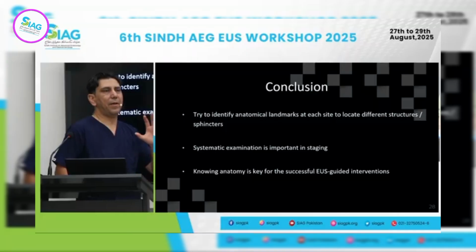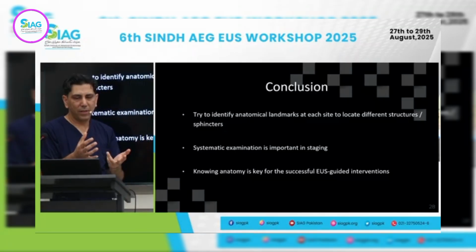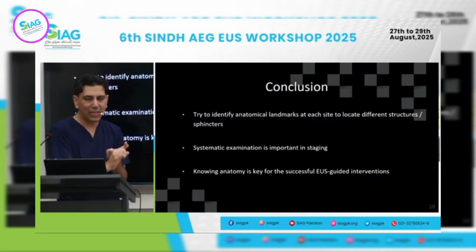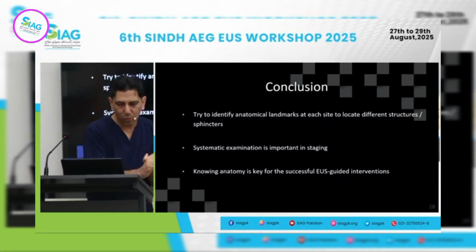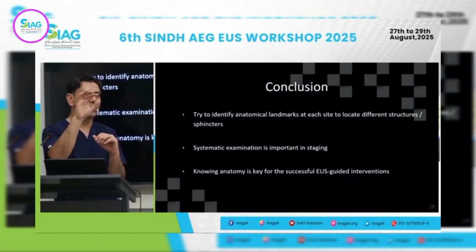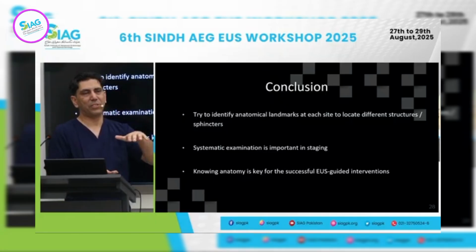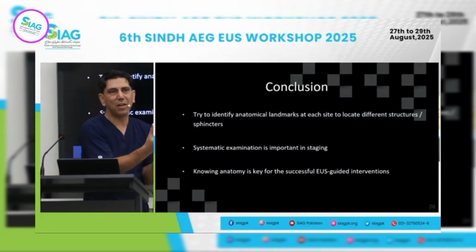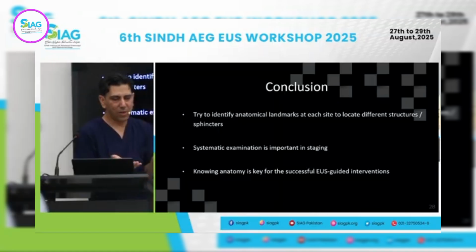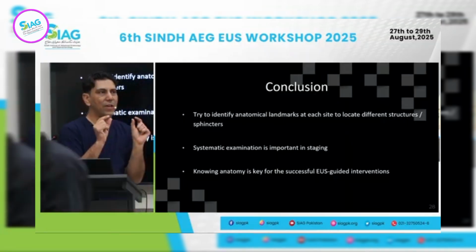So as I said, have a pattern in your mind of how to approach these patients, why we're doing it, what the clinical utility is, and a plan to approach. Then try to identify, keeping it in the 3 rectal stations and 1 anal station, the organs anteriorly and posteriorly, with only a slight difference in male patients in terms of what's anterior. Posteriorly, both remain essentially the same, the coccyx, and then focusing on the muscle layer.